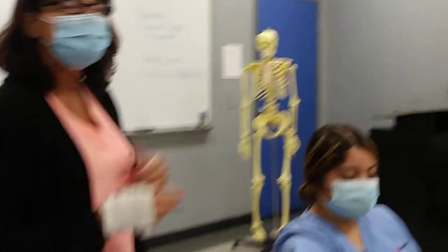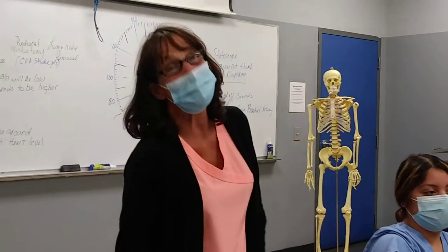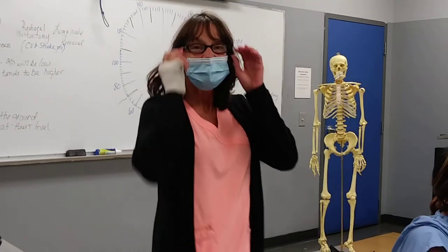So 122 over 84. 122 over 84, and that is your patient's blood pressure. Thank you so much. And hopefully this helped all with blood pressures. Thank you.